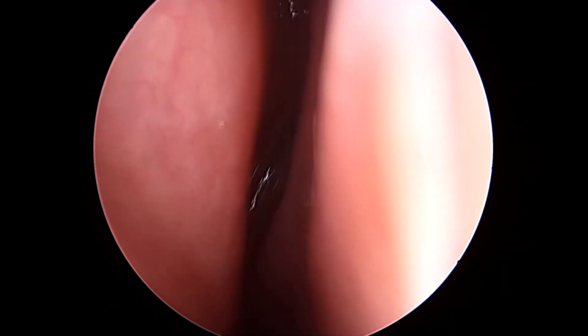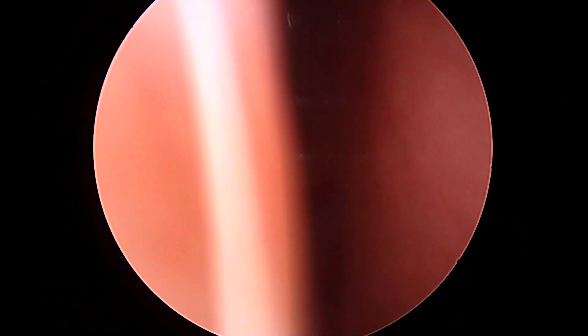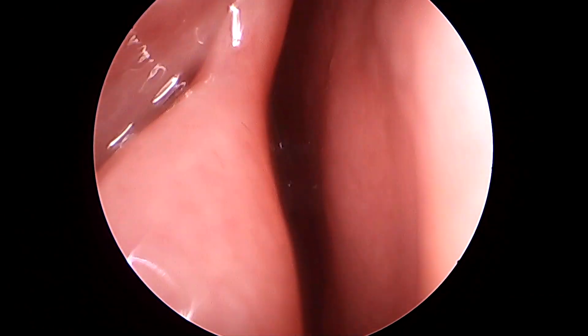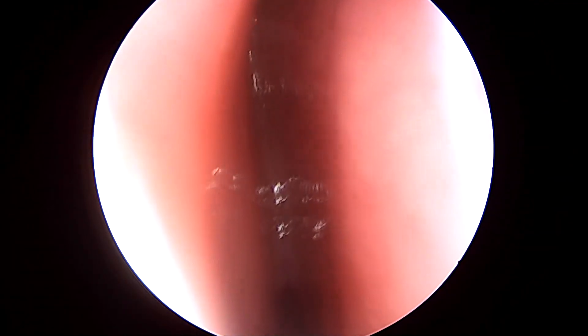I'll slightly turn upwards from the choana and examine the area between the nasal septum and the turbinate. That's the nasal middle turbinate, as you can see, along with the axilla — but I'm not able to negotiate my endoscope further inside that area.